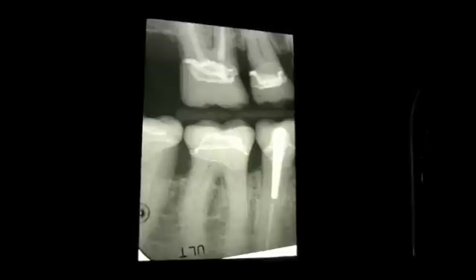So those are the X-rays for this patient, and we need to decide what to do. Normally you would go to the largest area and remove the decay there first, which is tooth number 19.